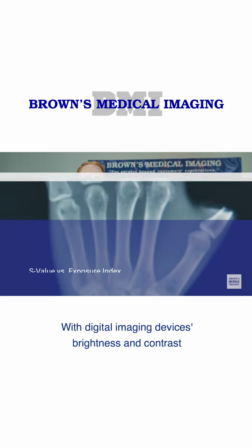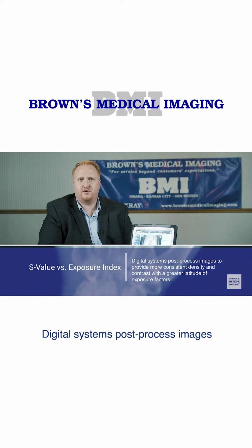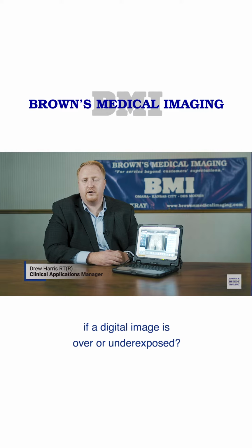With digital imaging devices, brightness and contrast are no longer dependent on exposure factors alone. Digital systems post-process images to provide more consistent density and contrast with a greater latitude of exposure factors. So how does a radiographer know if a digital image is over or underexposed?